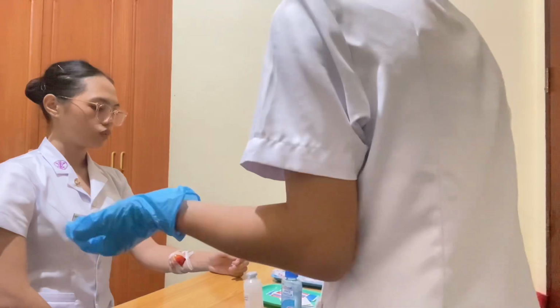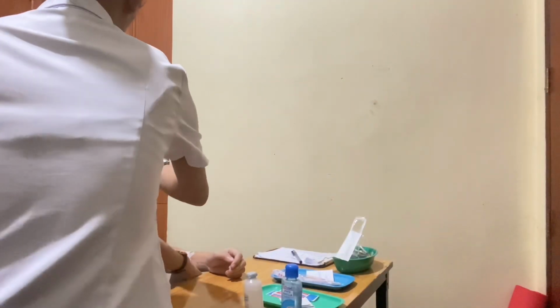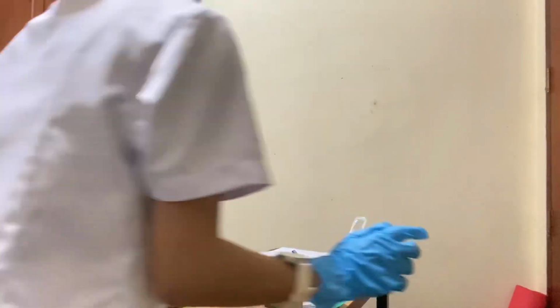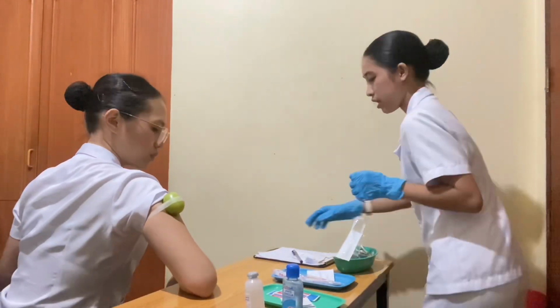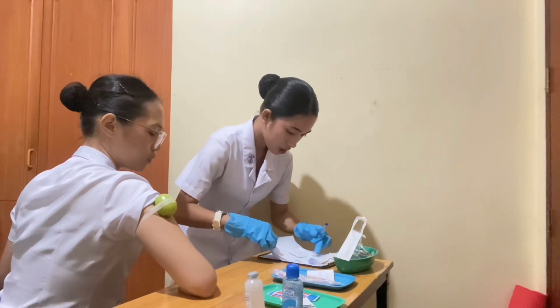Just going to go here in my part. I have other cameras, so I'll just show it to you. Again, check the doctor's order and the MAR.